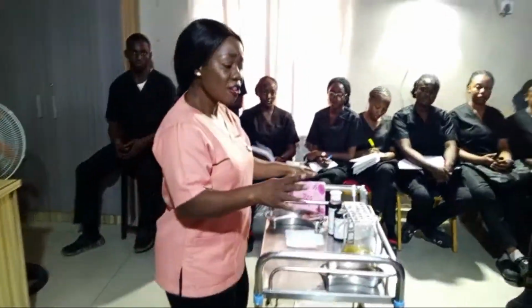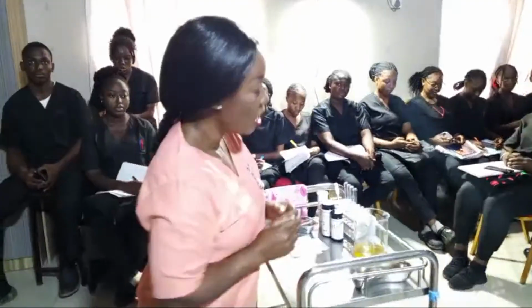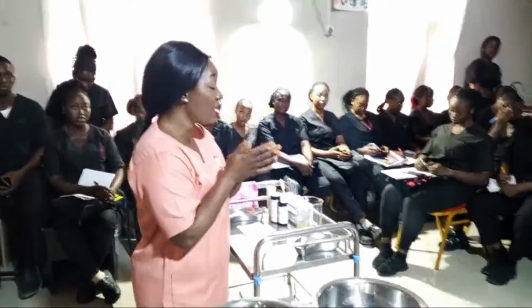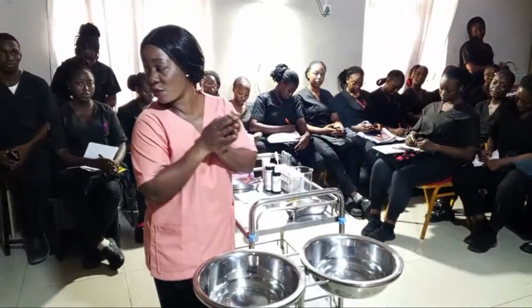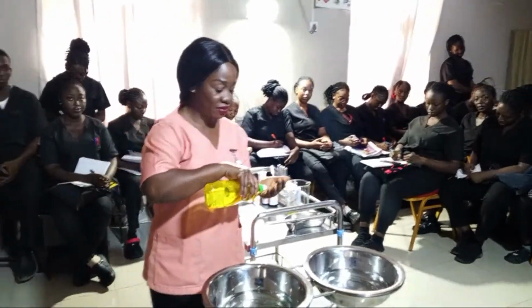So the next thing now is for me to wash and dry my hands. That is, you have to perform hand hygiene, right? So I have to perform hand hygiene. It's my liquid soap.